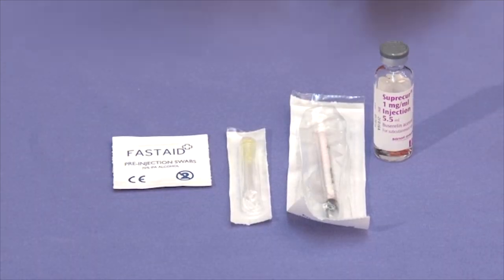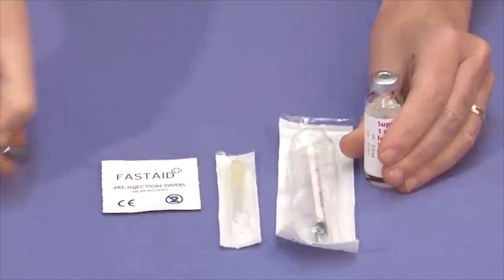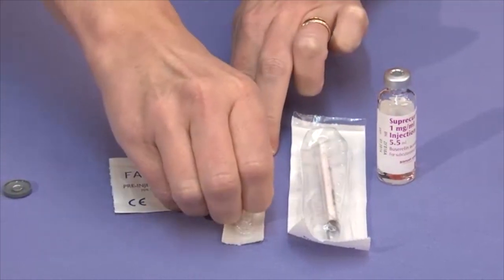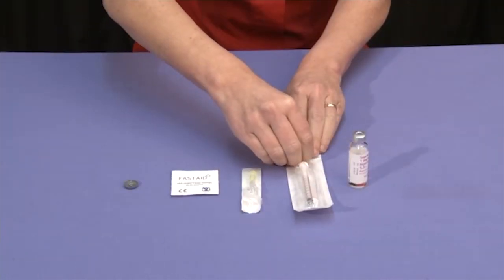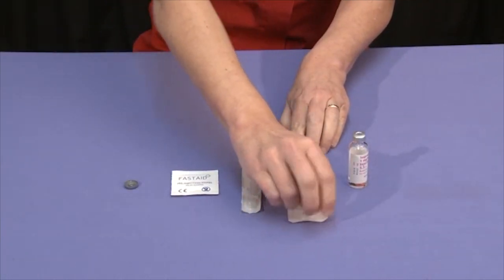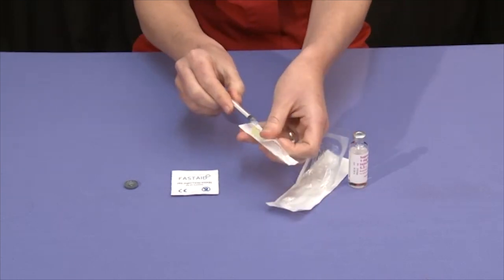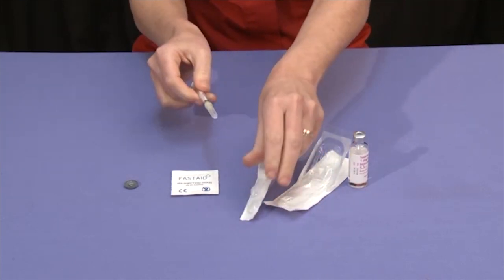First, remove the plastic flip top from the vial of Bucerulin. Break the seal of the packaging on the needle. Next, remove the syringe from its packaging and attach the yellow injection needle to the syringe, keeping the protective cover in place over the needle.